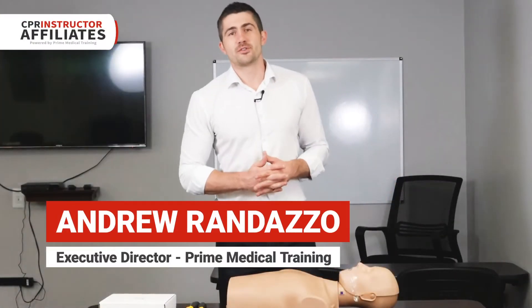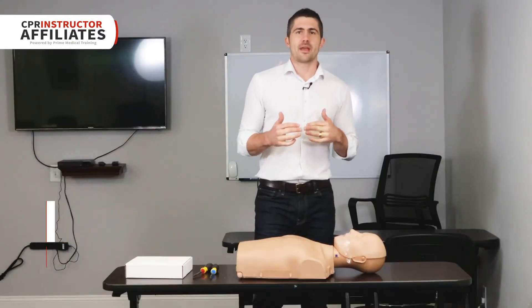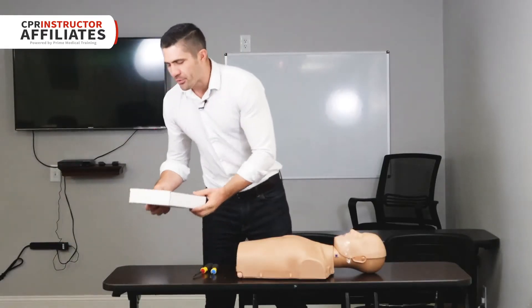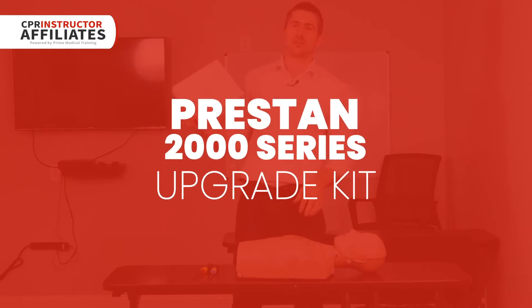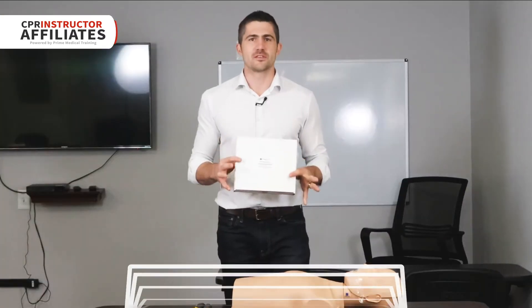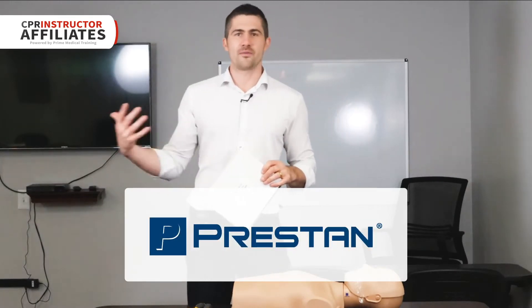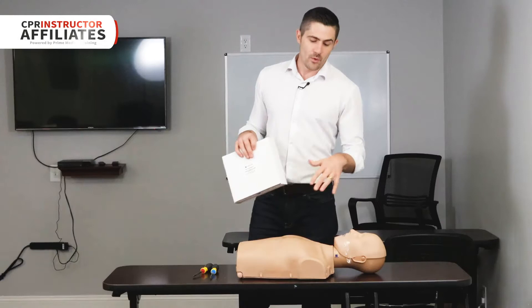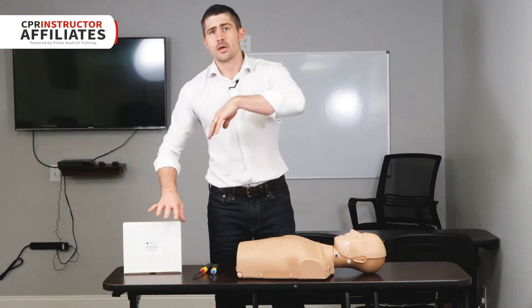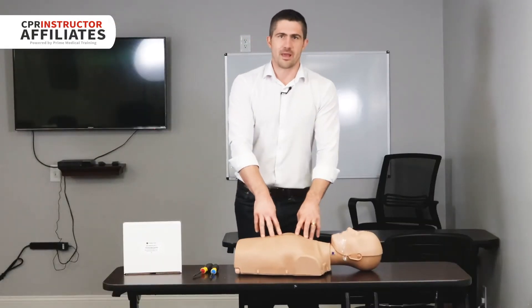Hey guys, Andrew with CPR Instructor Affiliates powered by Prime Medical Training. Today we're going to be taking a look at the Prestan 2000 upgrade kit. I'm really excited about this — Prestan sent this to me to review. We're going to take a look at how to actually install it and upgrade your regular Prestan mannequin to the 2000 series.